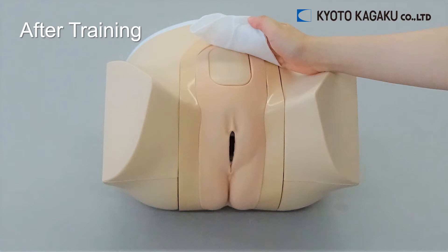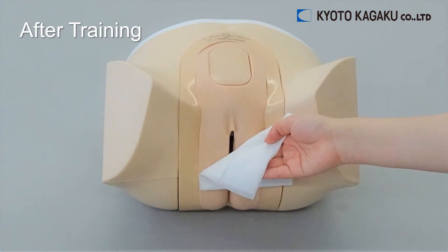After use, wipe off the gel from the abdominal part and wash the vaginal part with water carefully. Then let's have a look at the ultrasound images of the phantom.